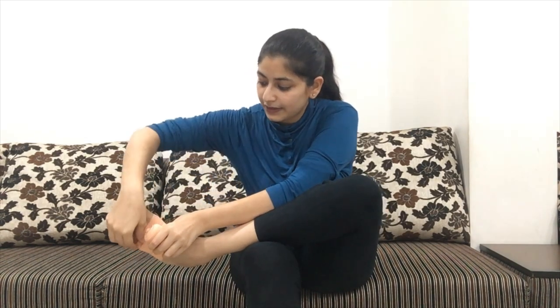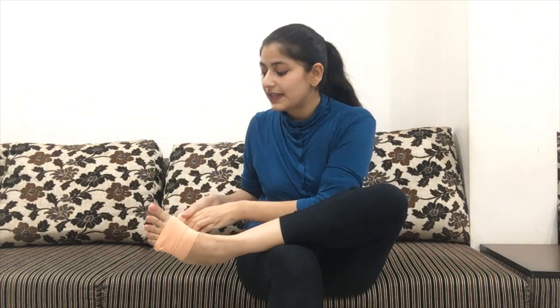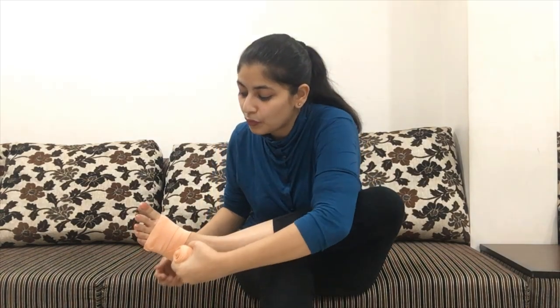So this is how we place it. We always begin from the foot and then we move upwards. And in that sequence mein hamara pressure bhi chalta hai. Neeche zyada pressure lagate hain, bandage ko tie karte hain, aur upar jaate jaate uska pressure come hote chala jaata hai. So let us see how we actually wrap it up. So the first layer, I put it out here, and here we go with the first round. Once this is done, iske baad mein isko maine yahan se tight kiya. And then uske half layer ke upar se maine doosra round liya hai. Usi se third round lete hue we move up.